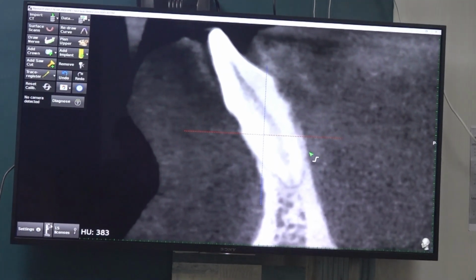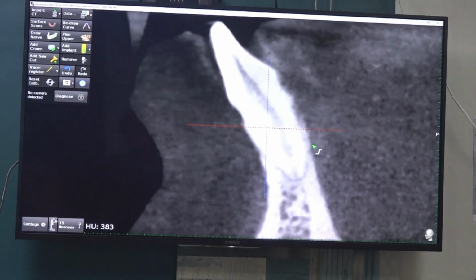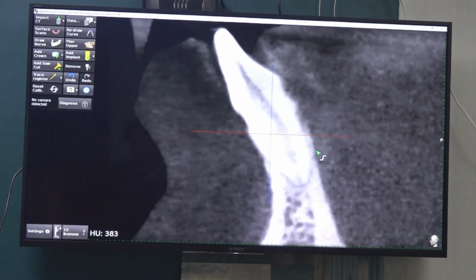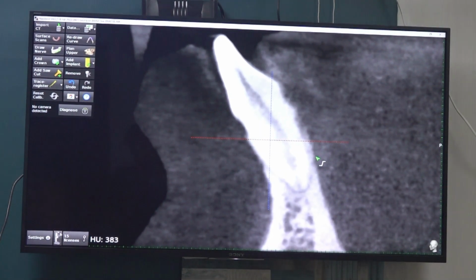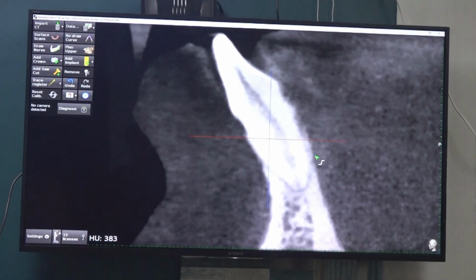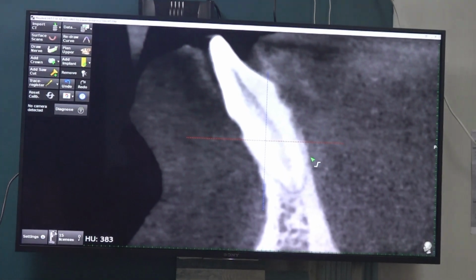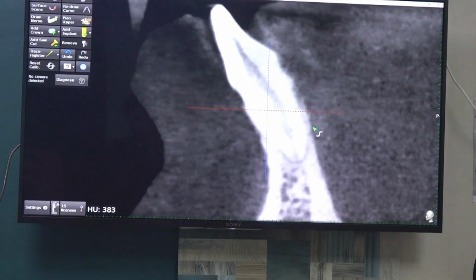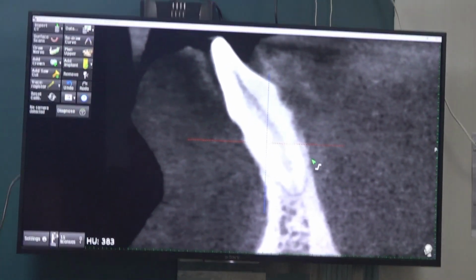So if you see the clinical picture, there is gum recession, there is enough prosthetic space, there is no need to open the flap also. Even if you open the flap, there is no need to do the alveoplasty. So I saw the clinical picture for this patient. The prosthetic space is quite decent, there is no need to do alveoplasty. When there is no need to do alveoplasty, there is no need to open the flap. Of course, if you want to see the buccal and lingual bone for access visibility, if you want to open the flap, that is okay. But for the sake of doing alveoplasty, there is no need.